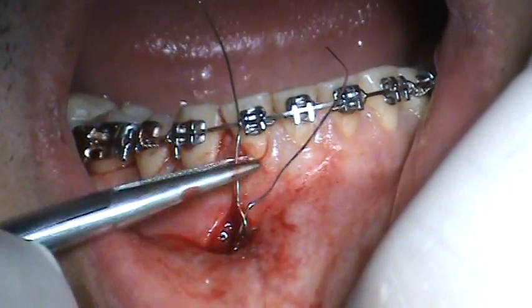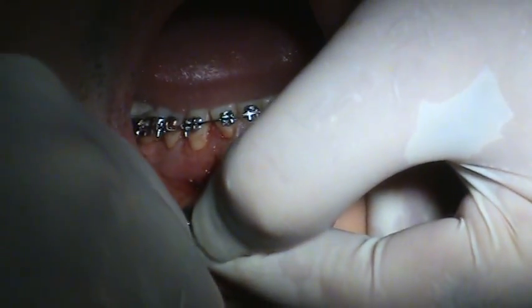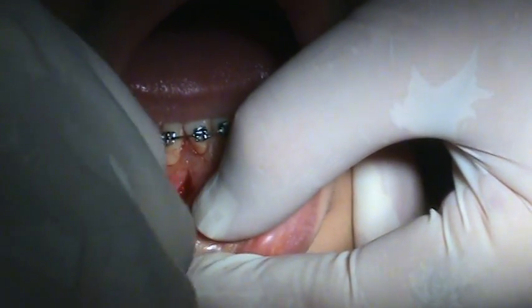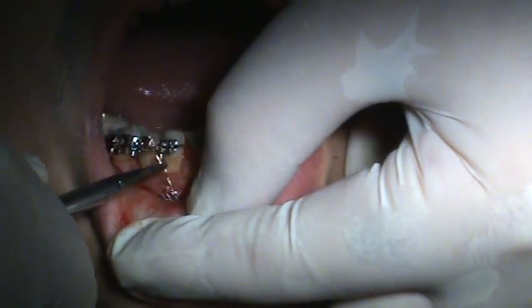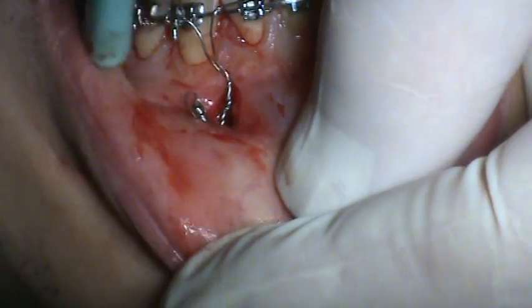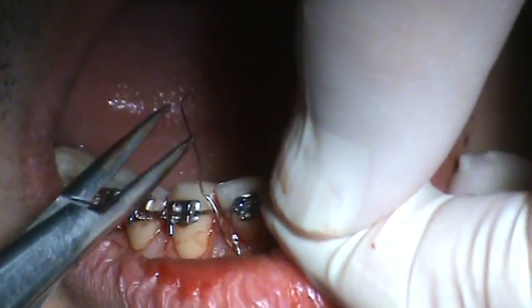I should twist it more. I find that when I twist it, I get tissue growing between the two things and it's hard to retrieve. It's hard to separate tissue. But I have to have some twist there anyway. Just fold it through. So this will be our eventual suspension wire.